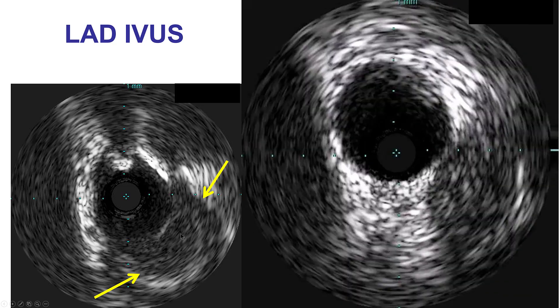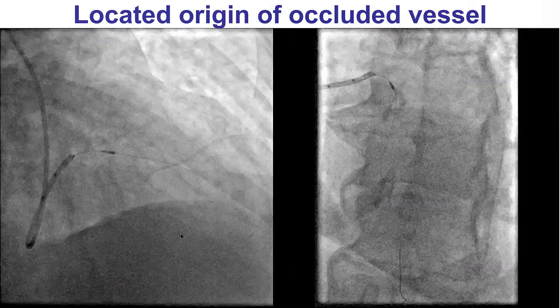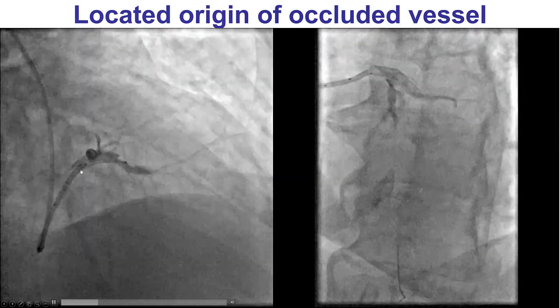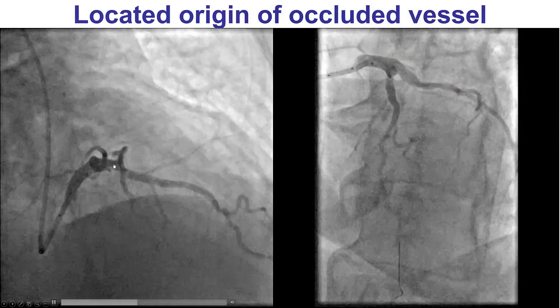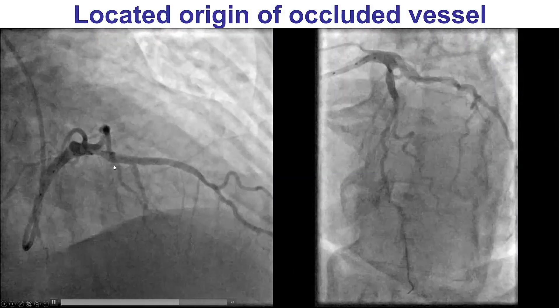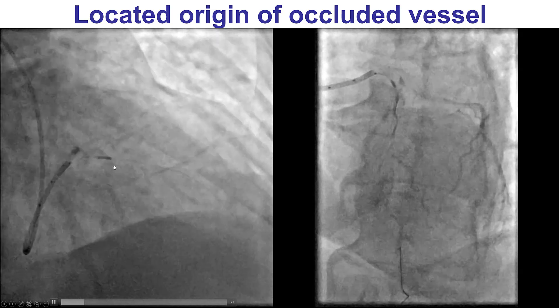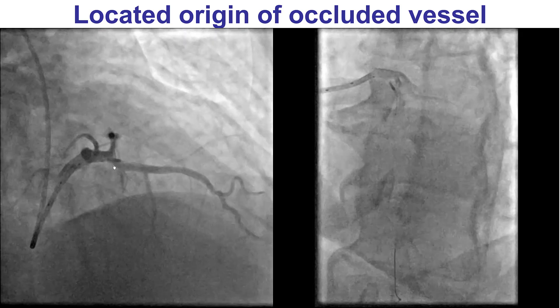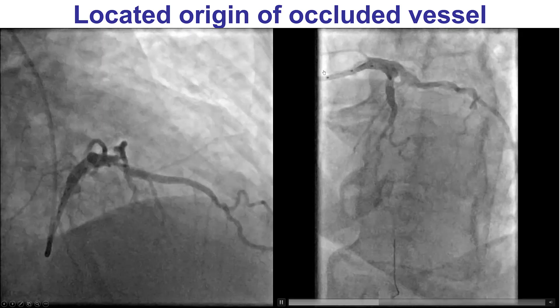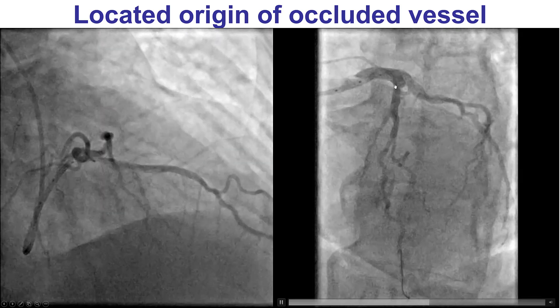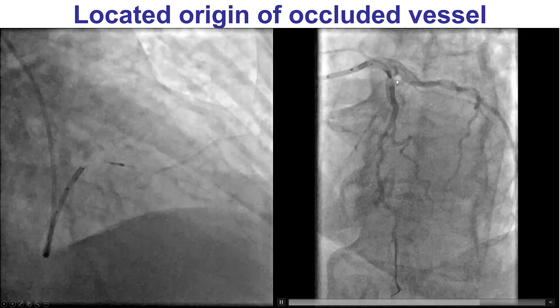That is close to the proximal LAD. Here is the vessel. And this is where the IVUS was located when we identified the ostium of the occluded vessel — an early diagonal vessel.